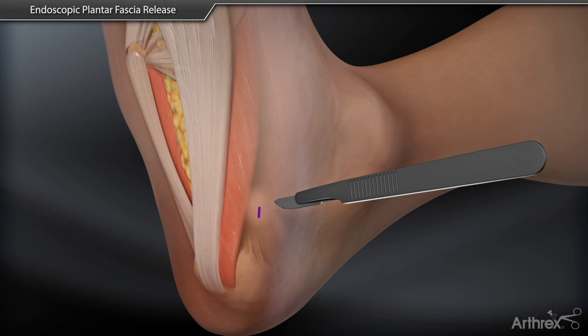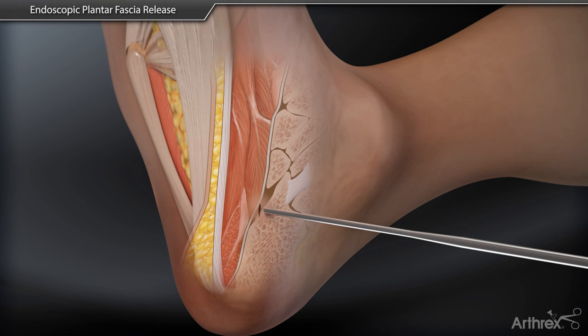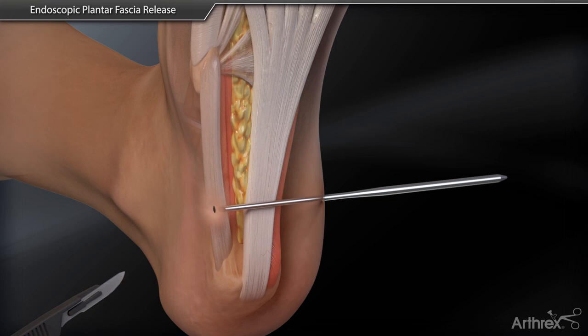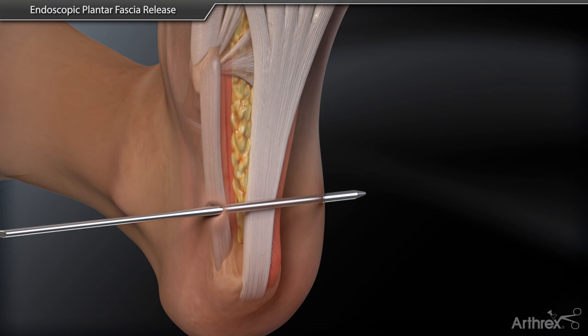A small medial portal incision is created on the plantar medial heel. The plane finder instrument is inserted inferior to the plantar fascia and guided laterally until the lateral skin is tented. A lateral portal incision is created and the plane finder instrument is inserted until the thickest diameter of the instrument is exposed laterally.